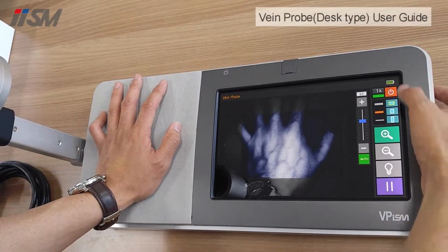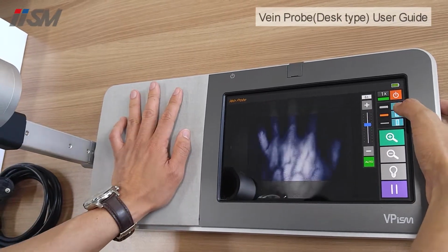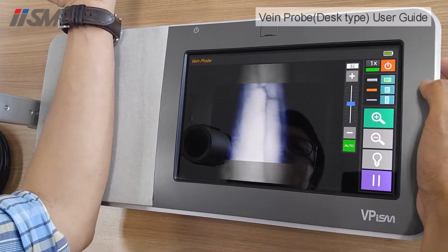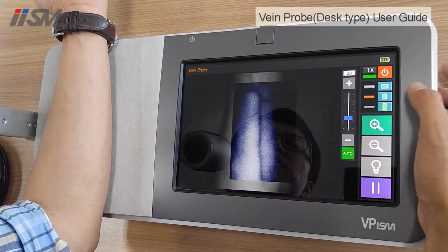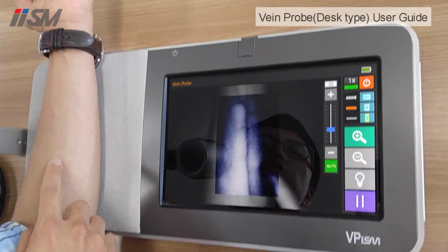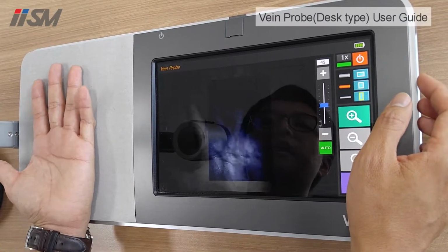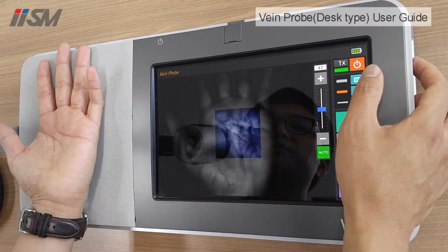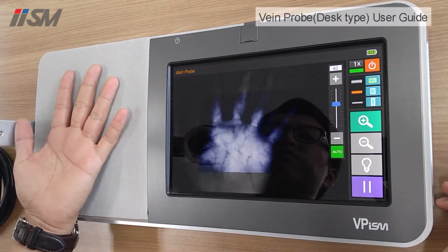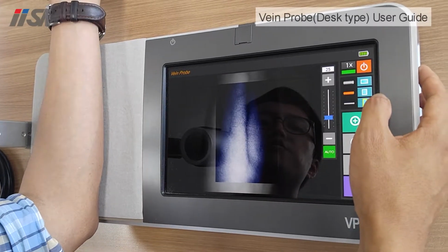Okay, and here you have the options. This button here corresponds to the region of interest. Right now you see this is at the upper button, and this is the region of interest. If you want to observe your arm, for example, you want the region of interest to be narrower than at the beginning, because this region is very important: it is the region the device uses to automatically adjust the brightness. For example, if you go to the hand, you can also have it like this to see a smaller area. Like that. For that one would be a bigger area. So for the arm, we would recommend using this narrower area when you want to observe the veins.